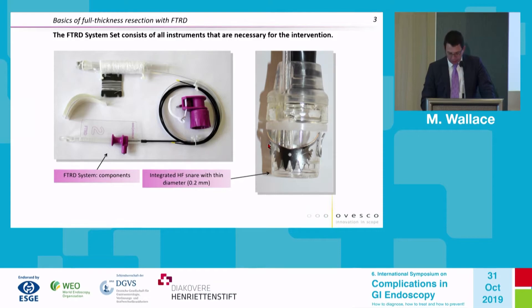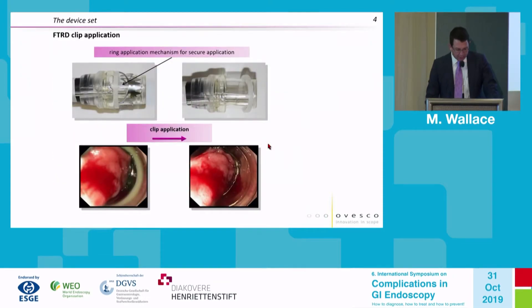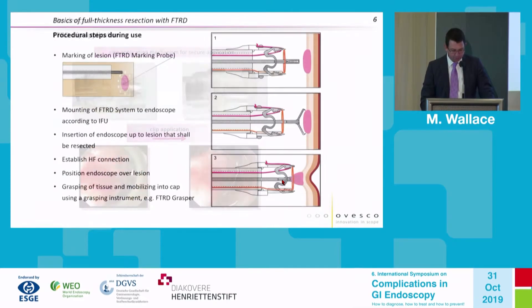Here again you can see the special ring applicator. When the clip is fully deployed, that ring advances to the end of the visible cap. It's quite easy to see in the endoscopic view: the white ring in its undeployed position and its deployed position after clip application.